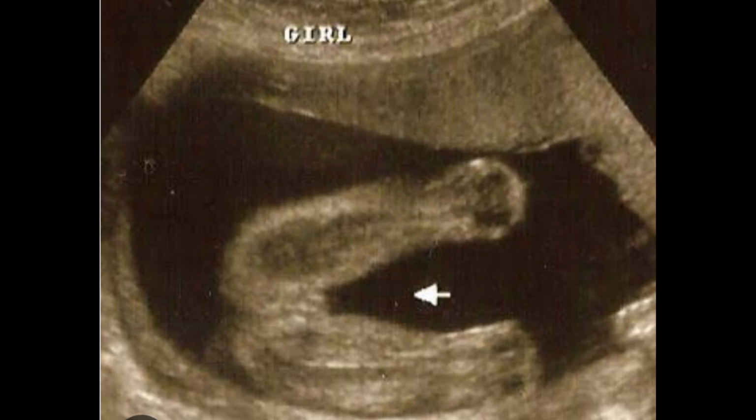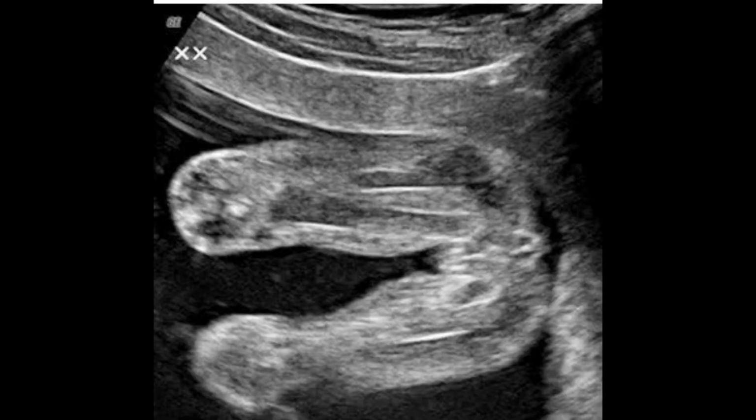Thanks. So this is an interesting ultrasound of a baby that is female. You can appreciate the femur bone in this high resolution ultrasound picture, and in between there is the female genital part that is just like a hamburger, and we call it the burger sign.